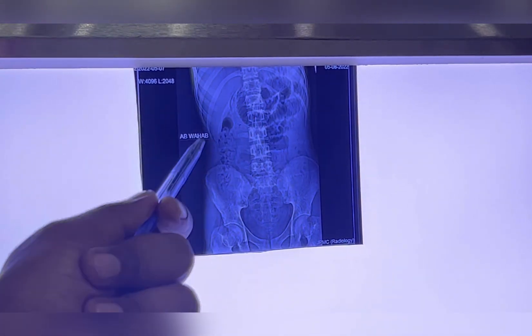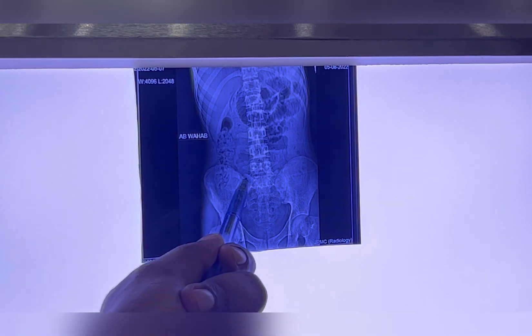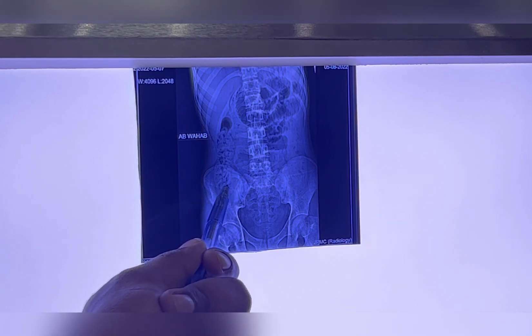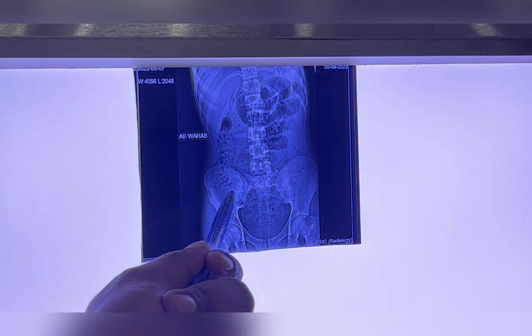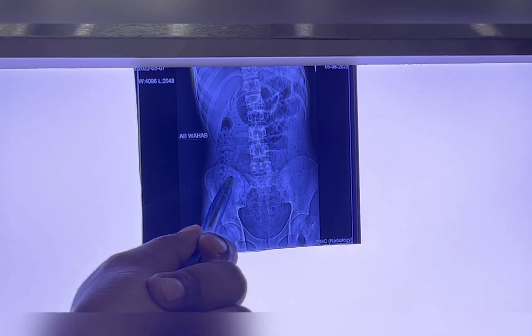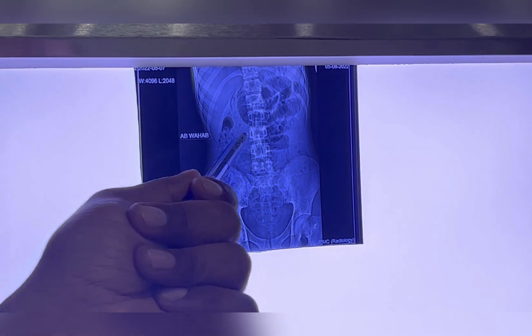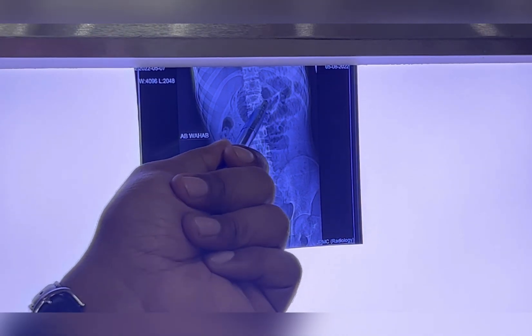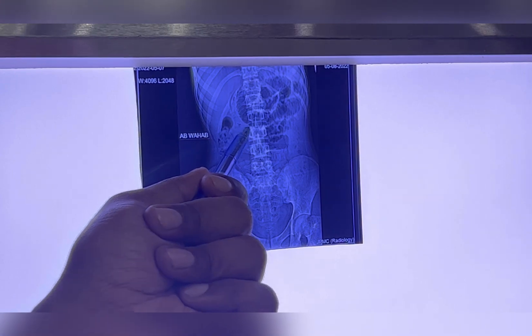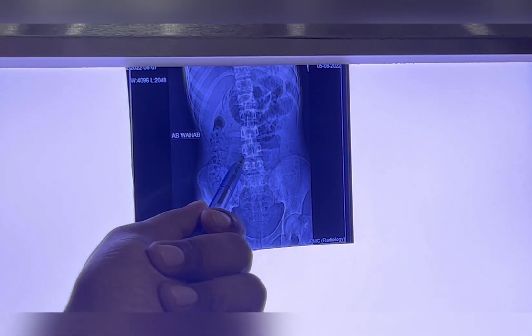Whenever you see an abdominal X-ray, you must first look at the right iliac fossa. If gas is present there, it means the obstruction is distal to it. If gas is not present there, the obstruction is proximal to it. Here it is empty, which means obstruction is proximal to the cecum — either in the ileum, the jejunum, or both. Here you can see both ileum and jejunum are visible, so most probably the obstruction is in the ileum. If only jejunum is visible, you can say it is jejunal obstruction; if both are visible, the obstruction is in the ileum.